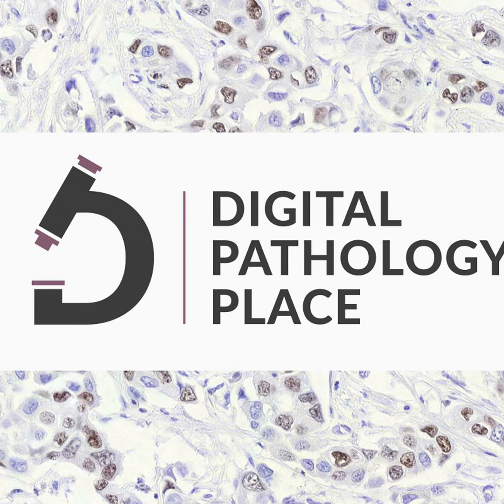That is extremely useful, because especially in the context of digital pathology, I can go and say, how difficult is it for me to replace their data with my data? Oh, you're using whole slide images? I'm using whole slide images. Let me put in my data. Now I'm in a position where I can simply just quickly replace their data with my data, click run on something that I know already works on their data, right?